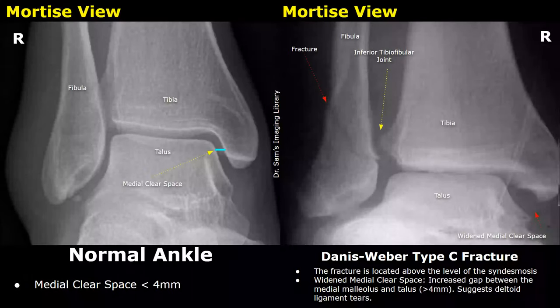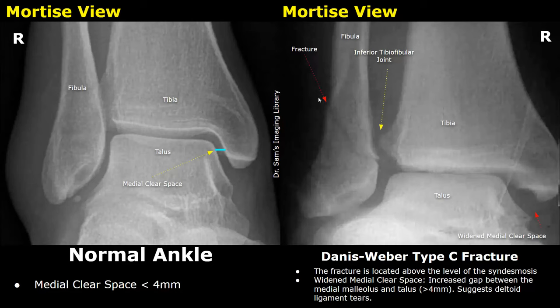Weber type C fractures occur above the level of the tibio-fibular syndesmosis. This fracture is above this joint, and along with the fracture there is a widened medial clear space. In the normal image, this is the medial clear space — normally this space should be less than four millimeters. However, in this case there is an increased gap between the medial malleolus and the talus of more than four millimeters, which suggests deltoid ligament tears.